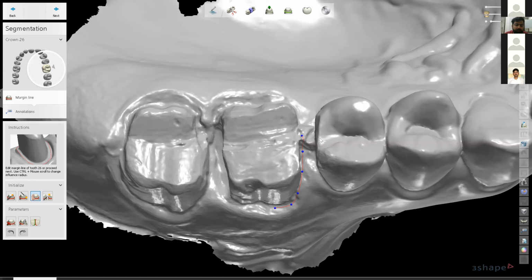Whereas the lab people buy the lab scanner along with the software so that they can design also, because their role is not only the scanning. Their role is designing also. So they have to look for the software. So they buy the scanner along with the software, which helps them with what they want to design.